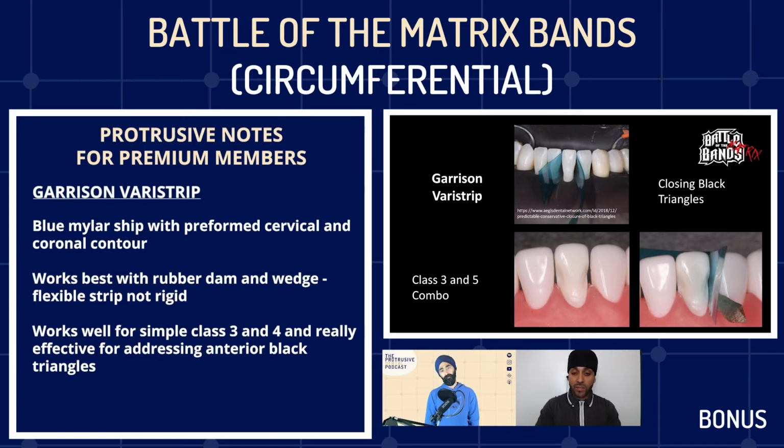And that's actually how I used to do it. And I have actually seen dentists online use it for simple class 2 and MODs, but I just never was able to do that. It just seemed really, really awkward for me, but maybe other people can make it work.